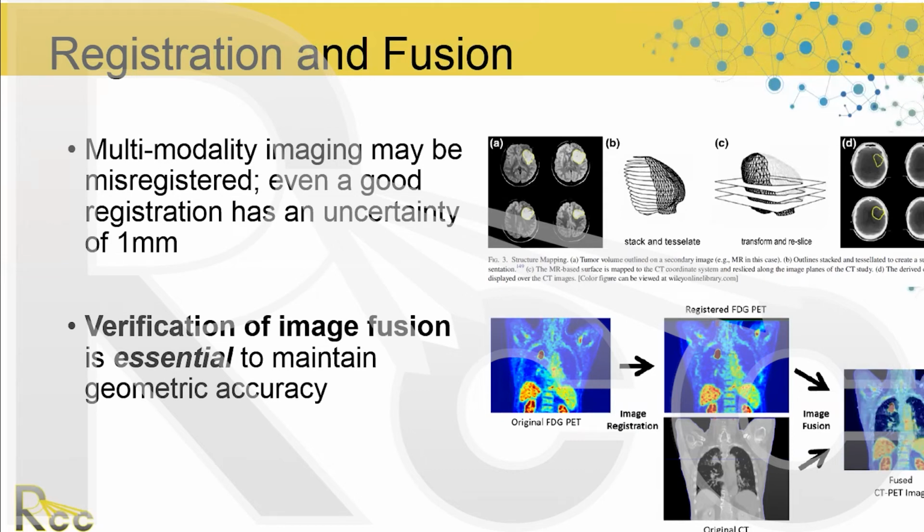so that you're more mindful when you're going through that process step. If I've built into my brain that image fusion is a large point where an error could occur, I'm going to be more mindful at that point. And that's what it's all about, knowing where those critical points are.